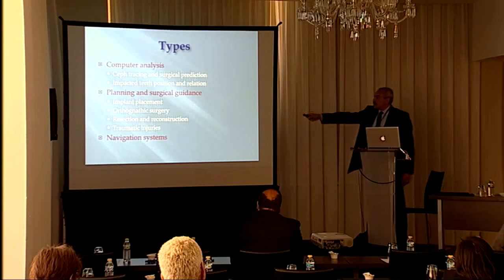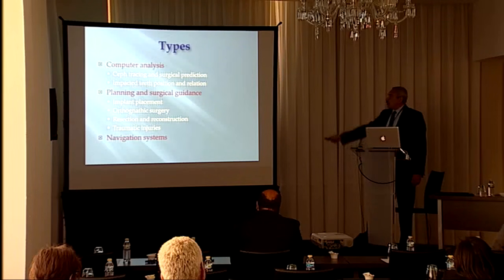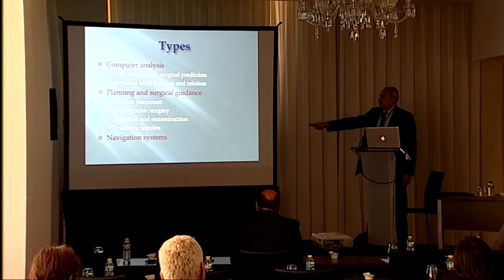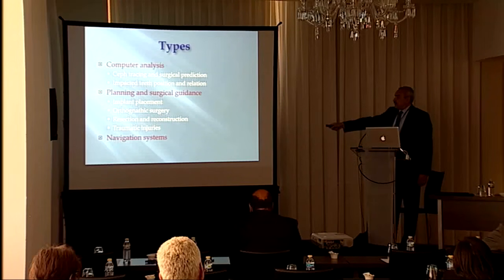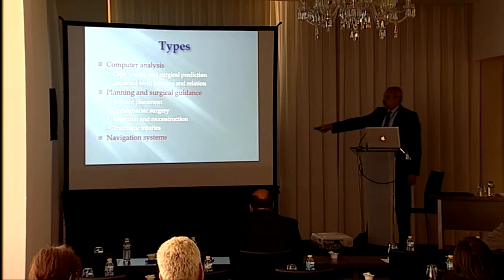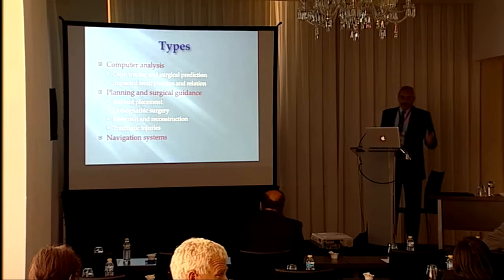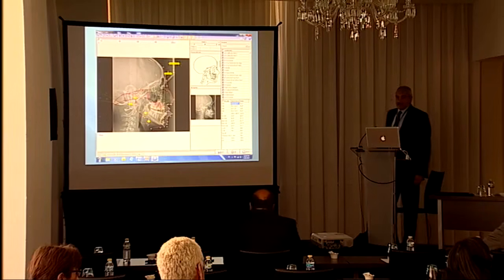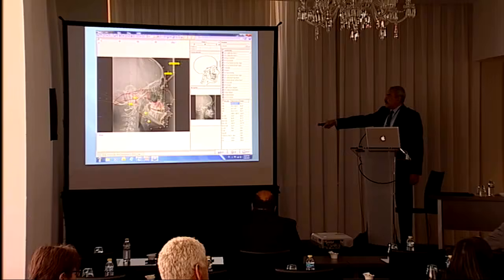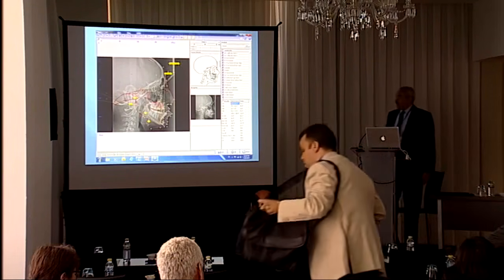Now we use computers for analysis like cephalometric tracing and impacted teeth position. We use the computer for planning and the application of a surgical guide, like implant placement, orthognathic surgery, resection and reconstruction, and traumatic injuries, and we can use them in navigation systems, and that's outside the topic of today's lecture.